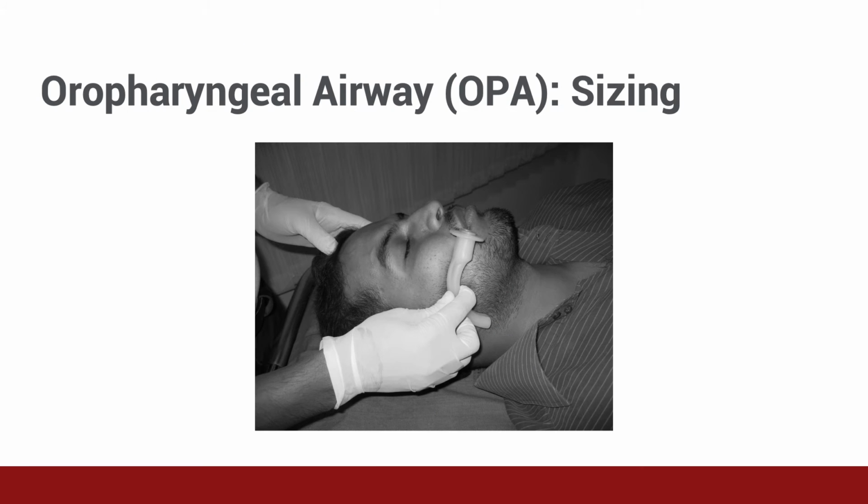Okay, now let's go through the steps of placing an oropharyngeal airway. First, can you tell us how to pick the correctly sized oral airway? Yes, the correct size oropharyngeal airway is one that reaches from the corner of the mouth to the angle of the mandible. If it's too short, it will not be able to properly open the airway. And if it's too long, it may cause damage to the upper airway structures.